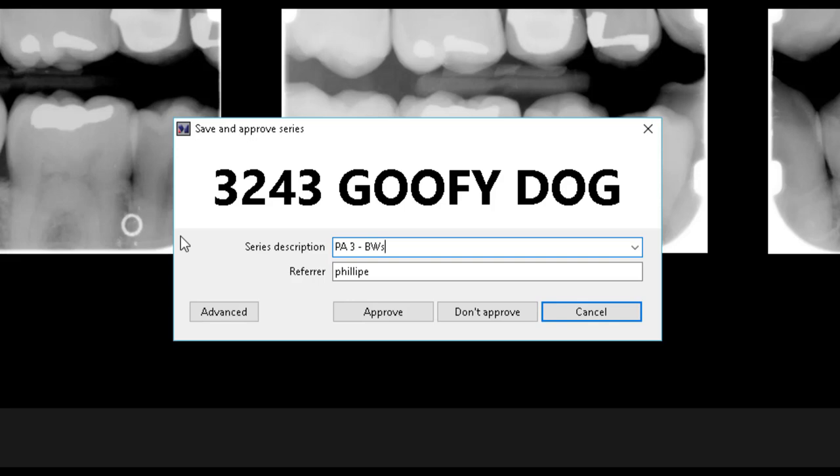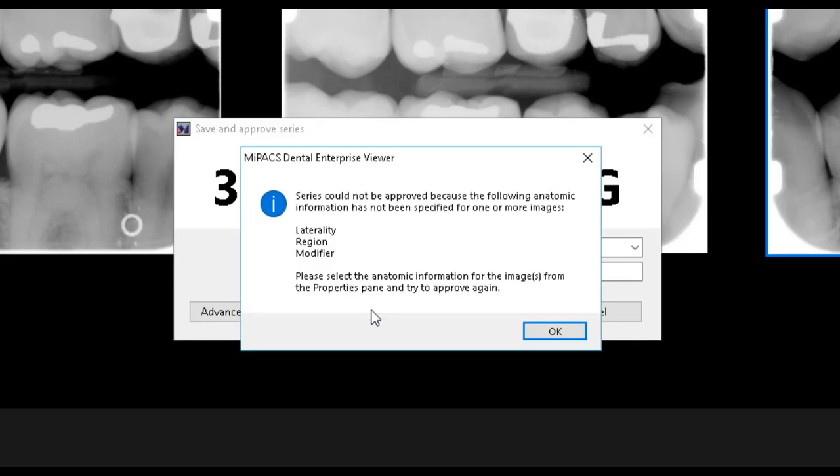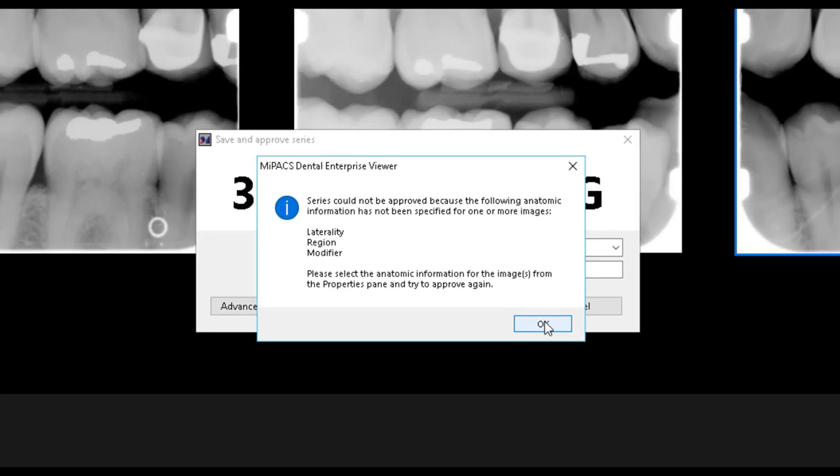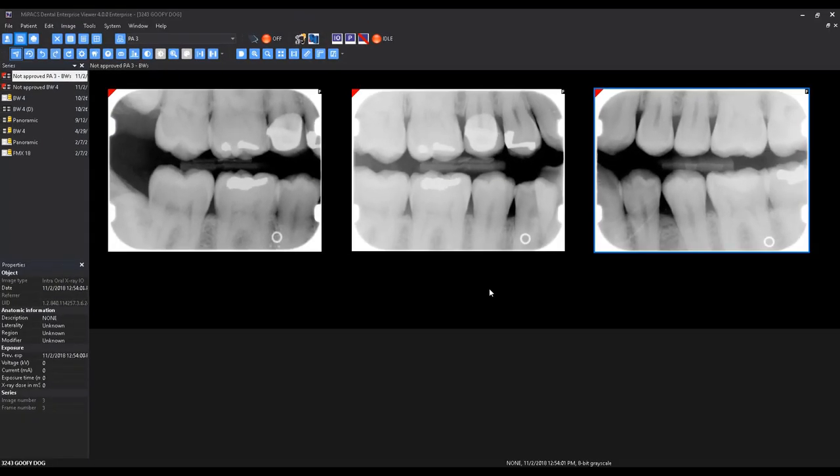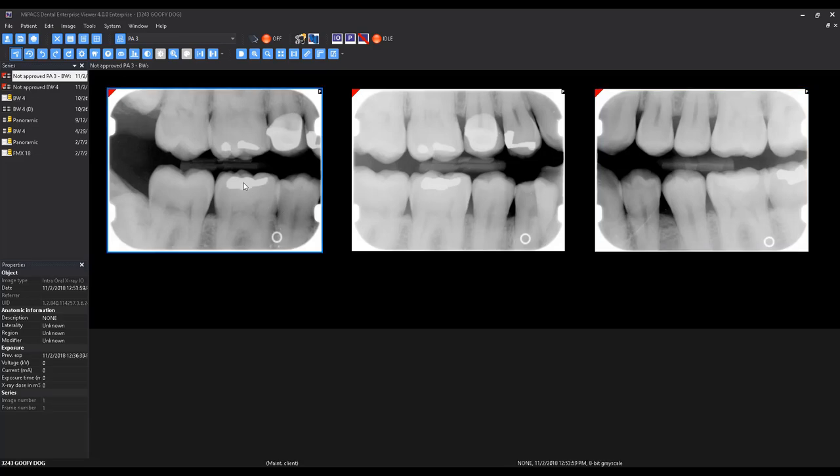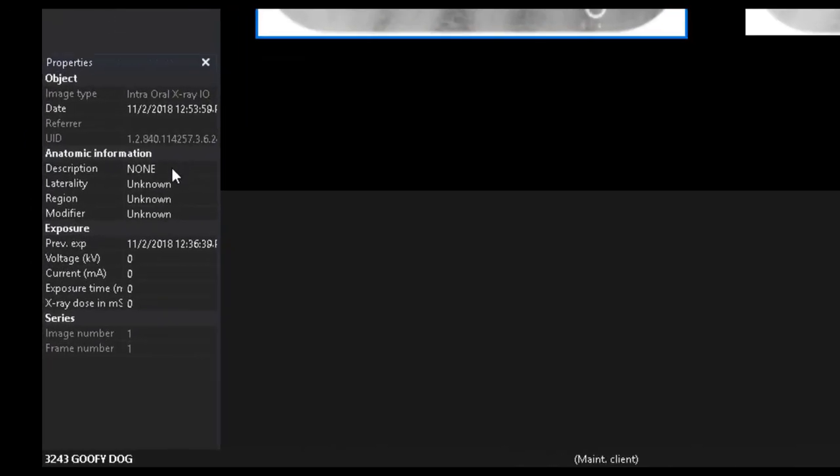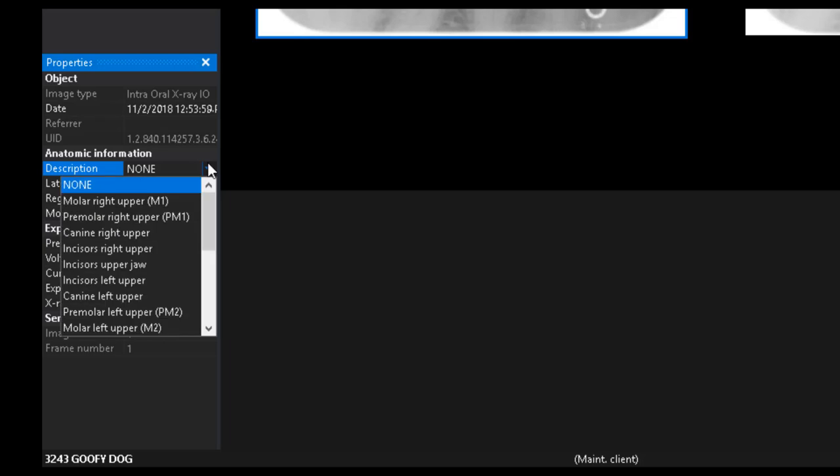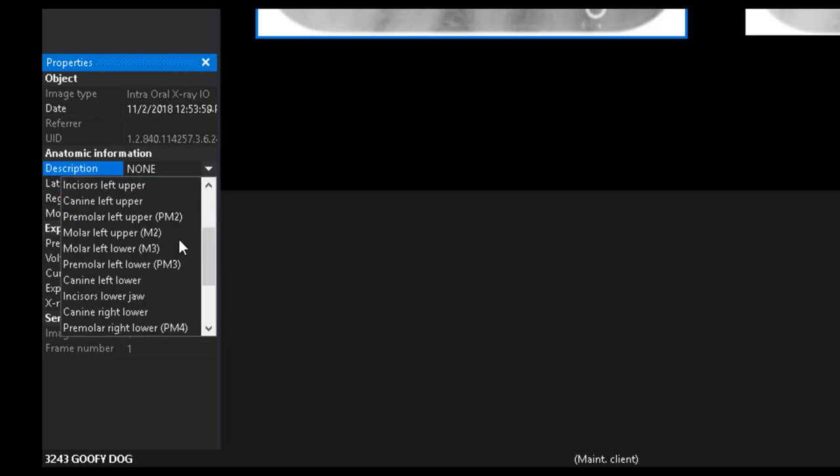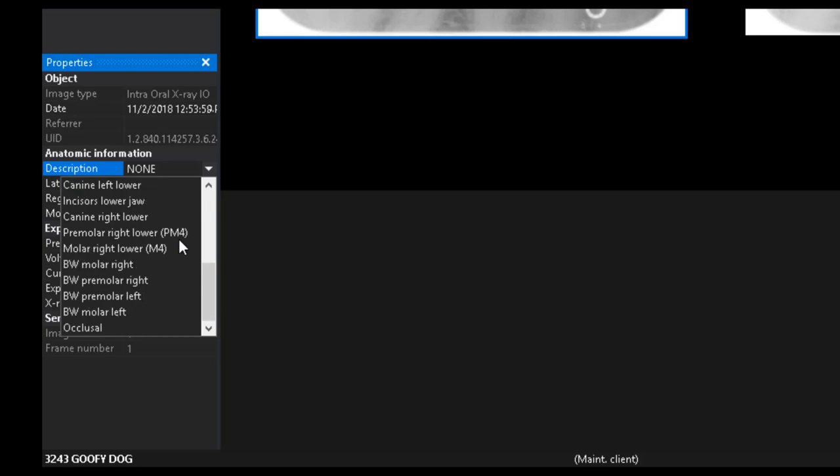The periapical templates are not equipped with the anatomical information predefined. Therefore, when saving images in a PA template, you may be prompted to define the required anatomic information. To accomplish this, select each image, then specify the appropriate anatomic description from the drop-down menu. Additionally, this will fill in the correct laterality, region, and modifier based on your selection.